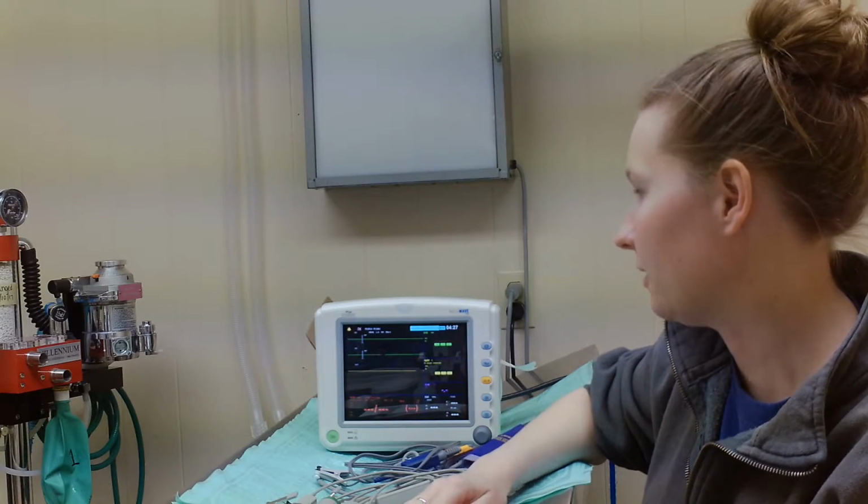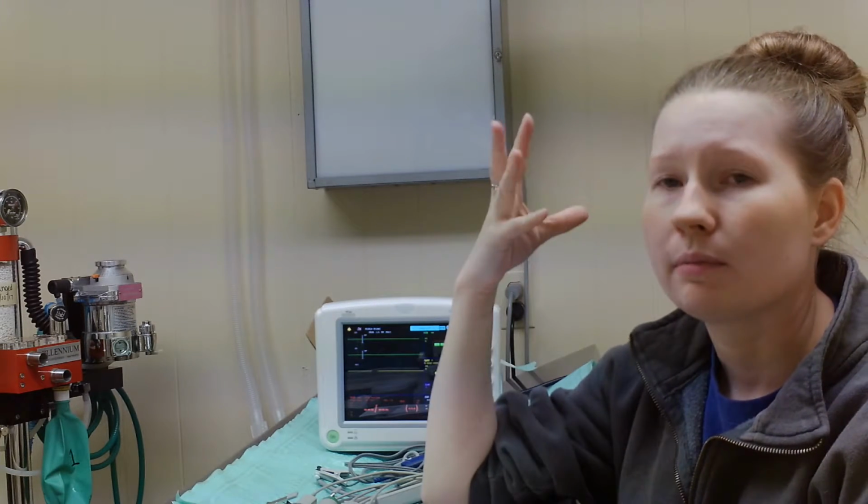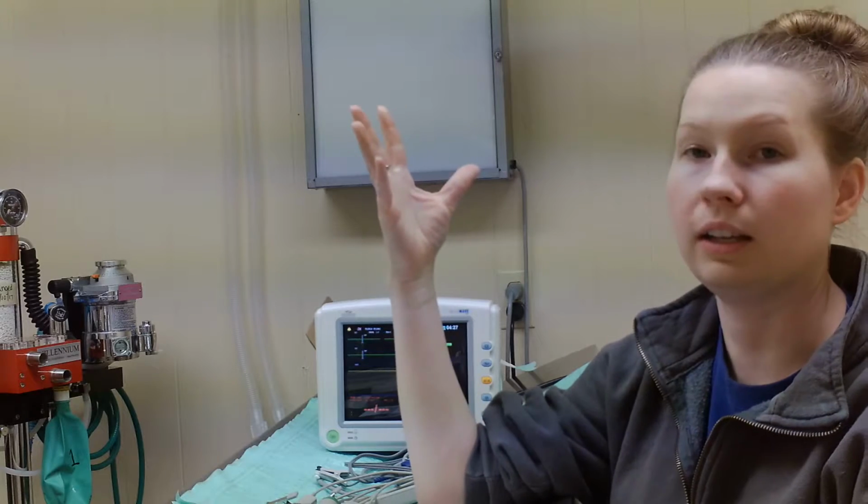And then the esophageal stethoscope is essentially just an auditory thing that you listen to for a heartbeat. If you're not hearing a heartbeat, it immediately gets your attention.